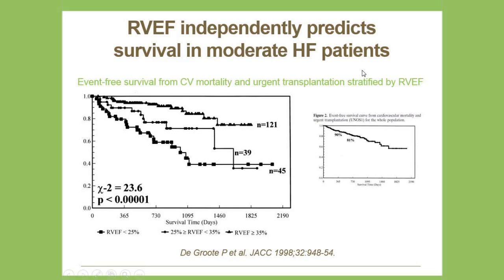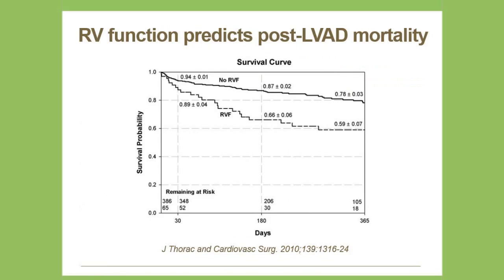How about we fast forward to a more modern patient cohort? These are patients with advanced heart failure who were listed for transplant, but in the process needed an LVAD, and received an LVAD in order to bridge to transplantation.